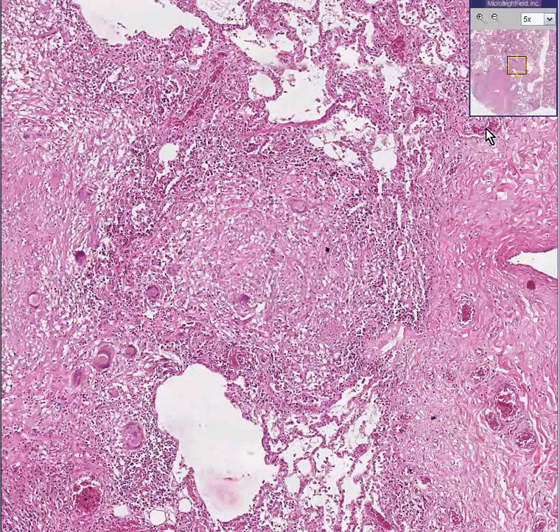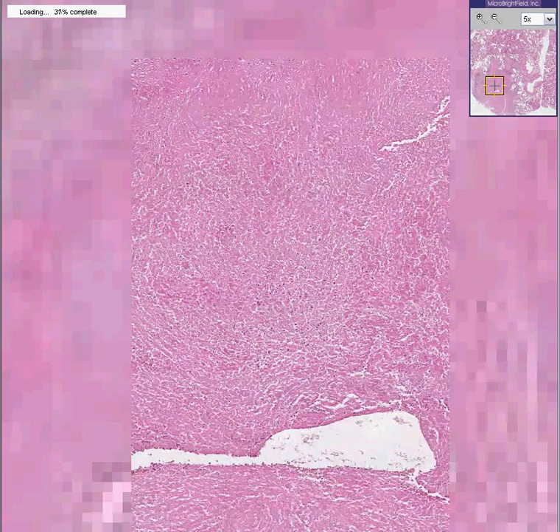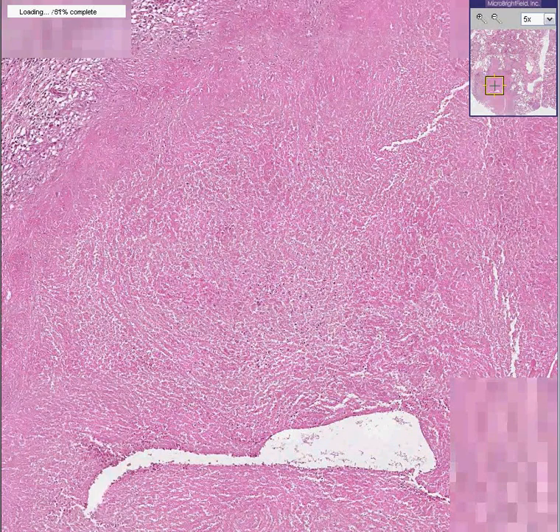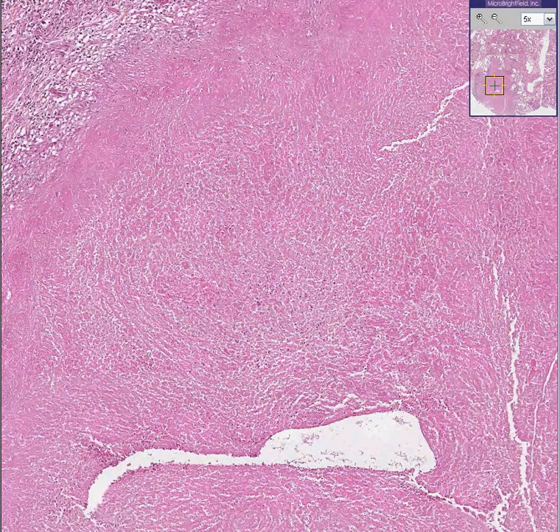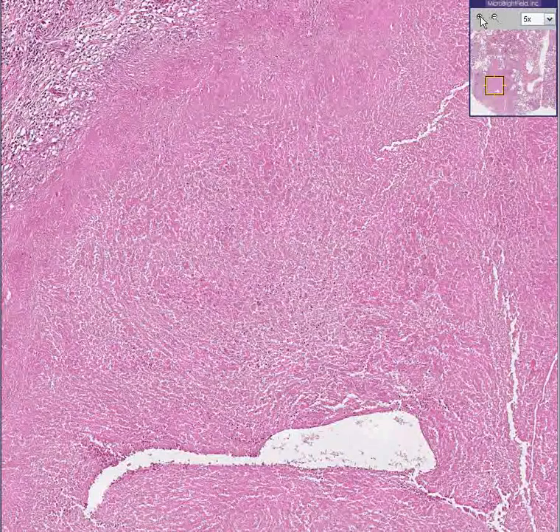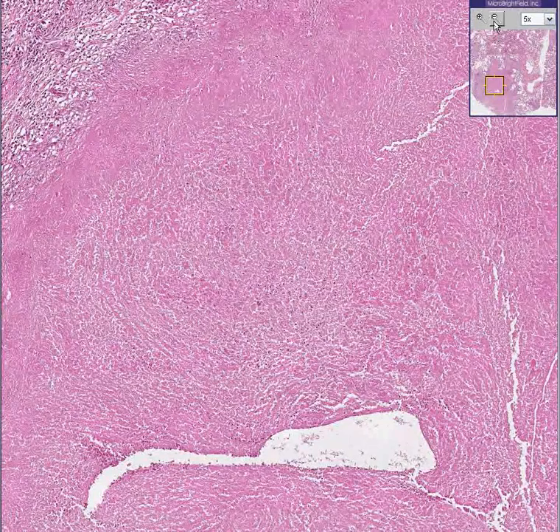Of course, when you get into the larger granuloma, the center of them is nothing more than granular crud in which you can't recognize any cell detail at all. This is necrotic, and grossly, if you cut through this, it would look like cheese. So that's how it got its name — caseous necrosis.